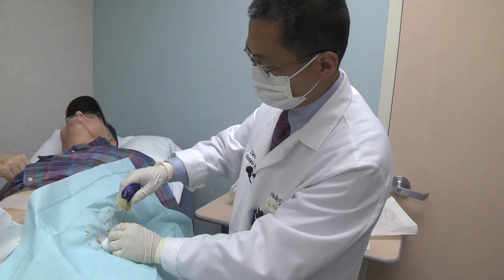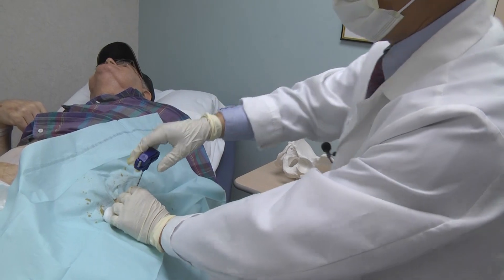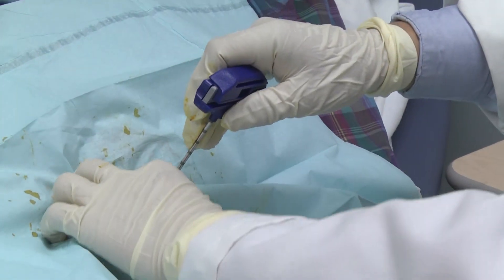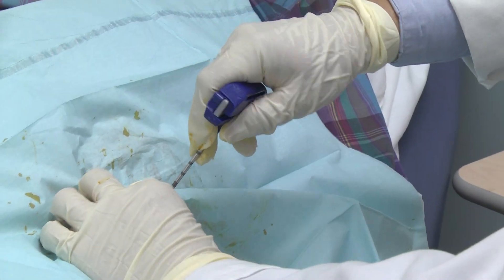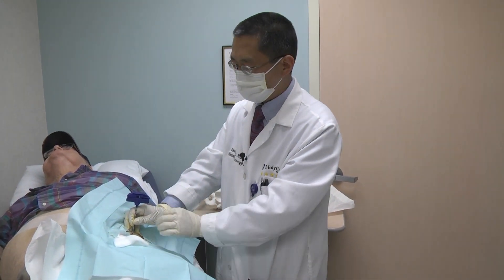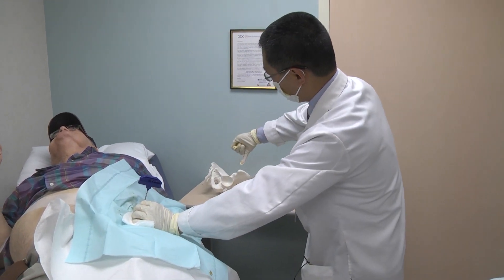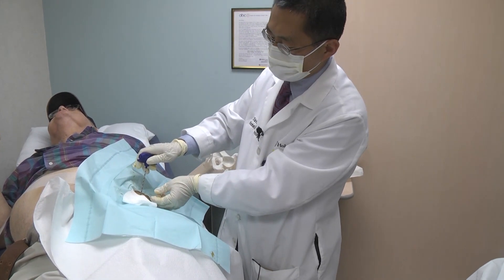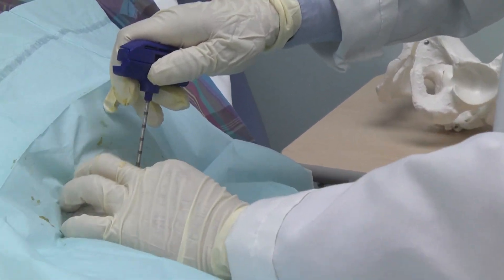Now put the needle in through the nick. While putting the needle in right over here, you have to feel the angle — the angle is the most important part, as different people may have slightly different anatomic structures. We put the needle into the little nick and try different angles to place the needle right on top of the bone. Right now I can feel it — I'm touching the bone. Very shallow. Next step, I'm aiming at the right angle to start to drill.